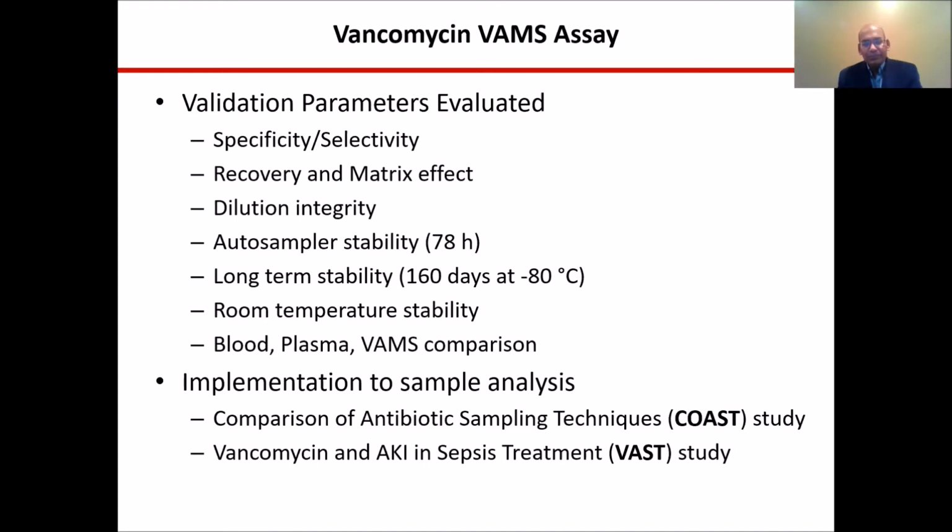So once the assay is validated, we have implemented this in two ongoing clinical research studies. The first one is the comparison of antibiotic sampling techniques, which is called the COAST study, which is really looking at a correlation between microsampling via finger stick, which is really capillary blood, versus arterial or venous sampling collected at the same time, within 5 minutes of each other.